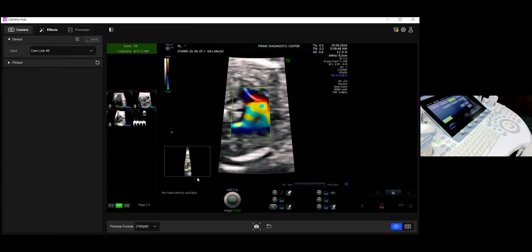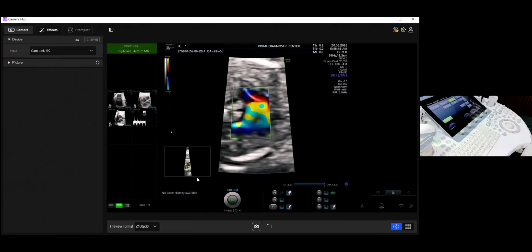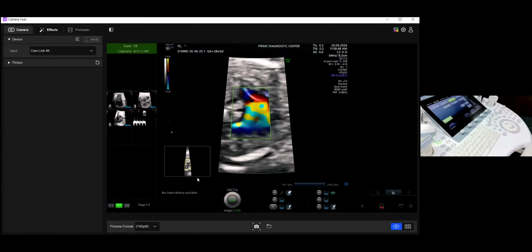So, no questions online. Let me ask people whether on site. Yeah. Sir, can you please show us the extended view, that bicaval view and aortic arch and ductal view in one of the patients? So we would do it. And sir, the sample report of fetal echo and all the views. I forgot. We'll do it.